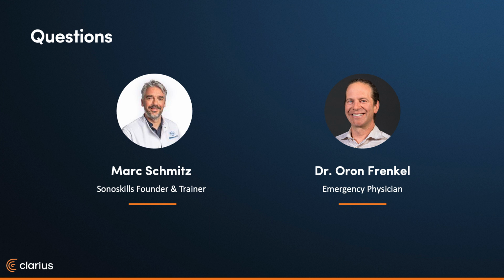Let's see, we're getting through most of these questions. I think this is a bit broad and maybe hard, but could you speak to sort of best practices for bursitis, or is it more nuanced? I would think it's more nuanced depending on where the bursa inflammation is and what the symptoms are. Yeah, there's a lot to tell about the bursa. That's a whole topic for a new webinar.